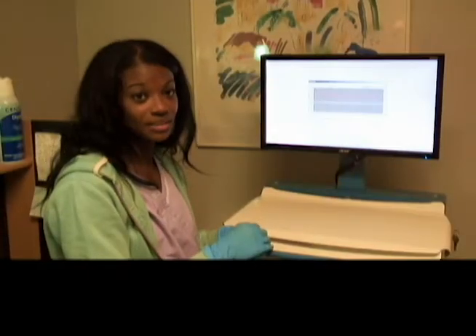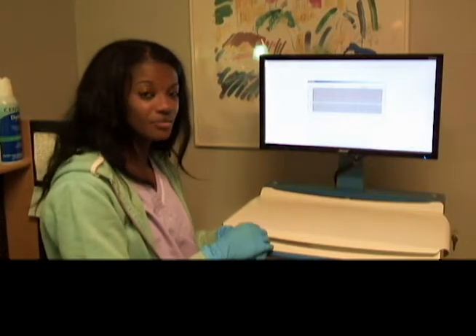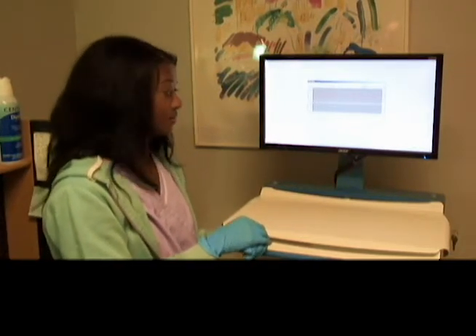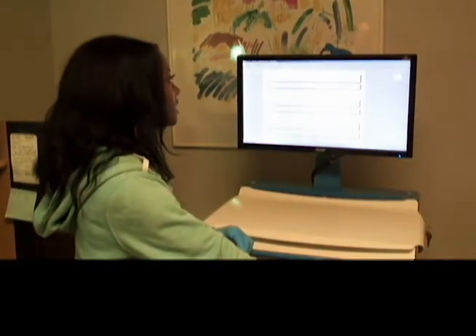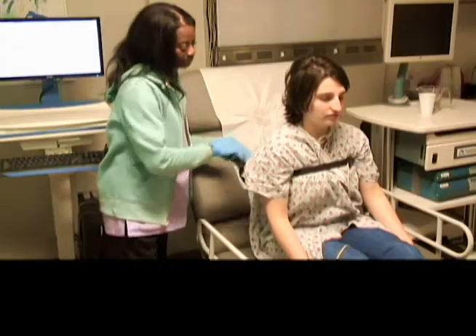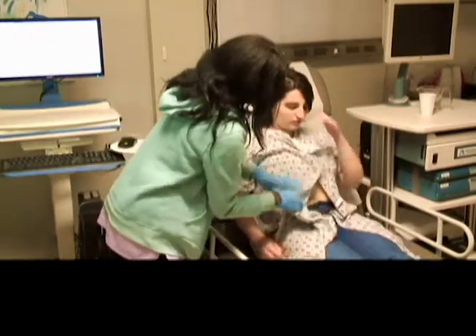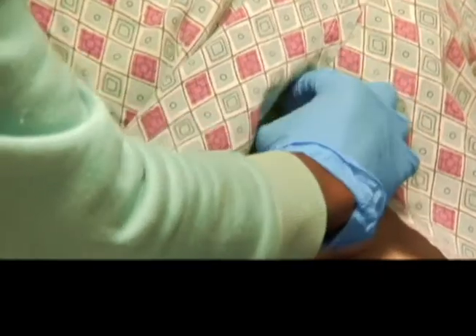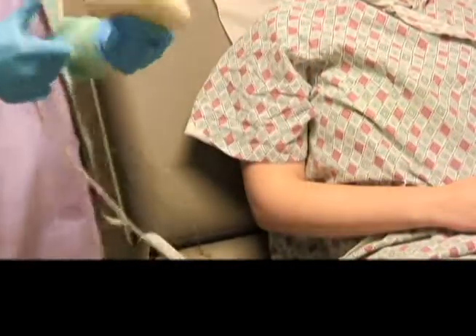Now that the test is complete, we can either select Finish to end the test, or we can extend it out for 10 more minutes if we've noticed artifacts. Now you're going to select Finish, or selecting File and Save. Right, now that the test is complete, we can remove the equipment from the patient. This concludes our study.